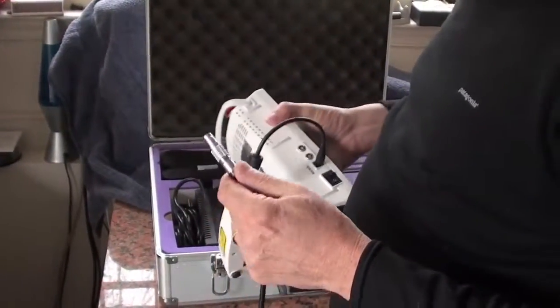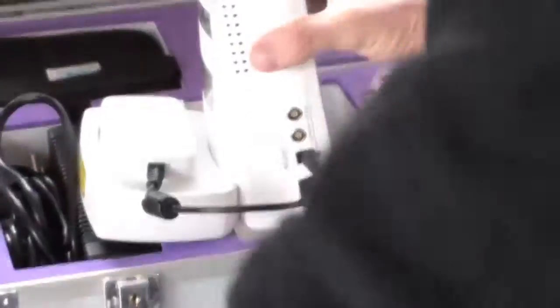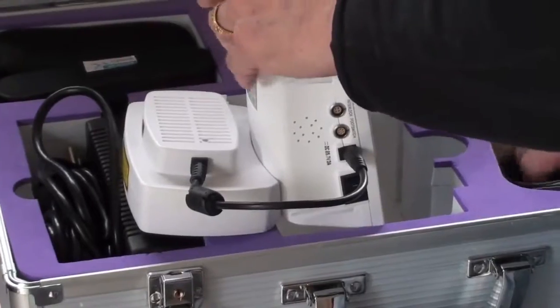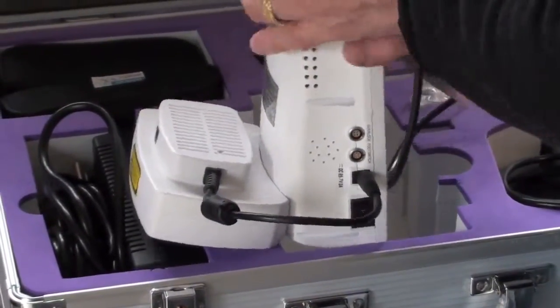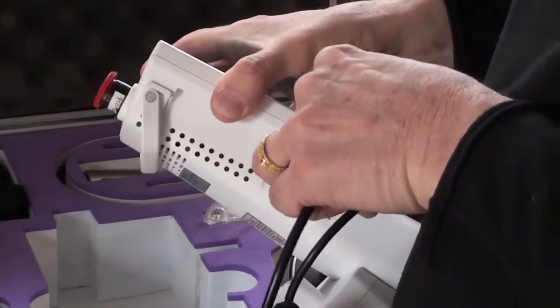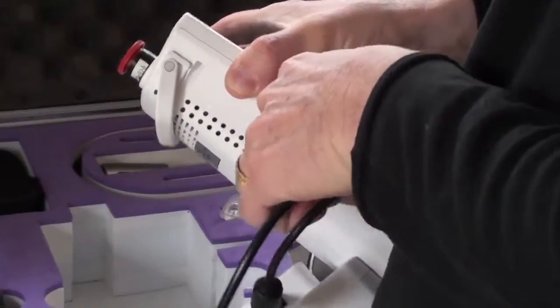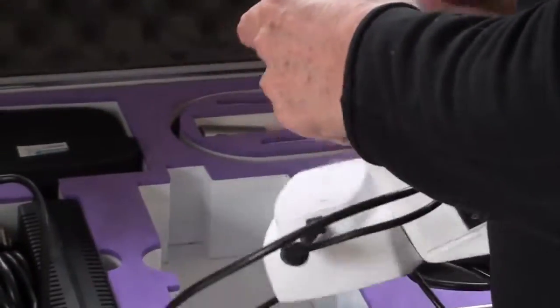It's all on the side. Remember, it's 12 o'clock high. It's not the same foot pedal. We'll take the foot pedal, this one. So the laser has its own specific foot pedal. 12 o'clock high, you stick it in. Should be very easy. You never force it.